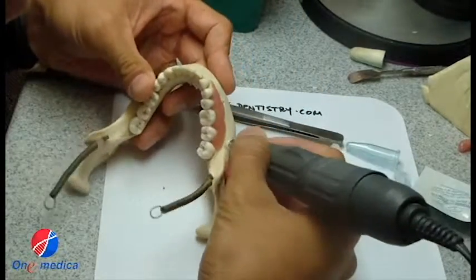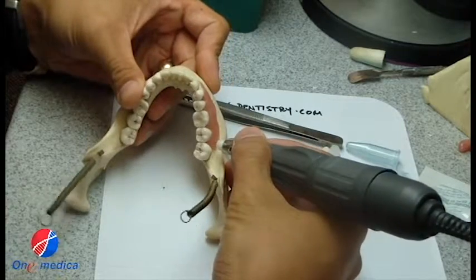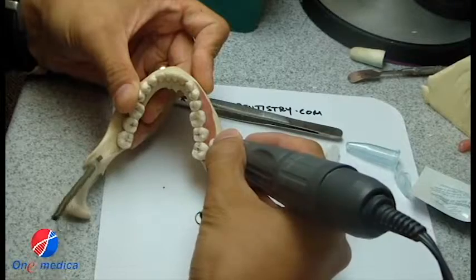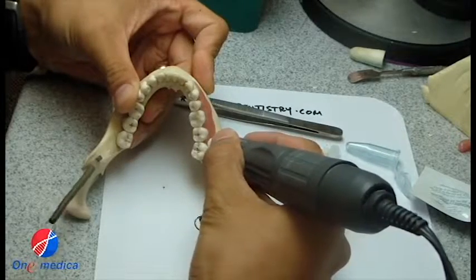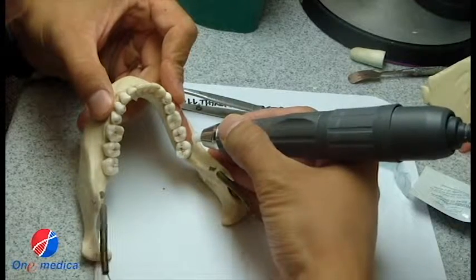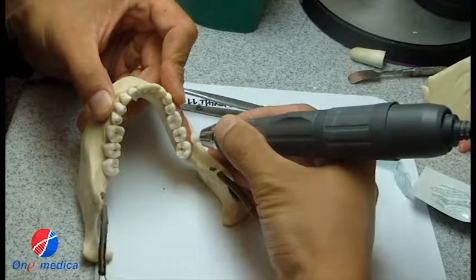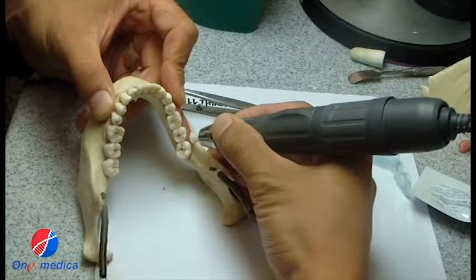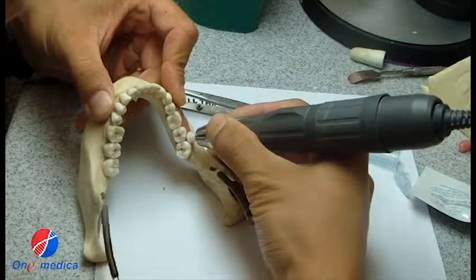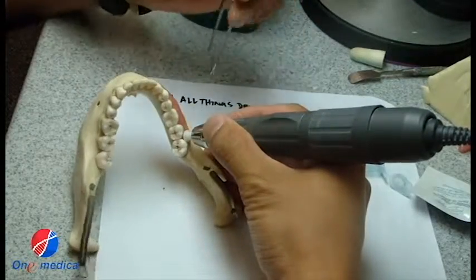Let's go back here. Same thing, I'm going to angle apically. Let's see if you can see that. Okay, that's better. So in it goes, and I'm pushing, pushing, pushing. Some thick cortical plate, and I've stopped.